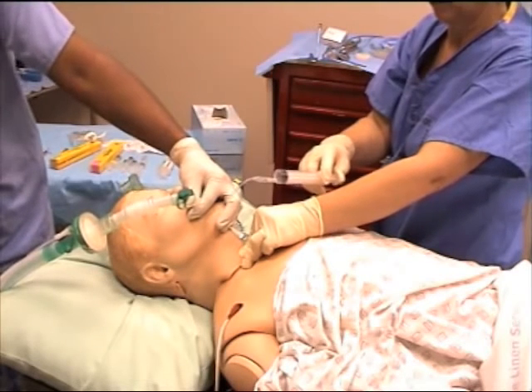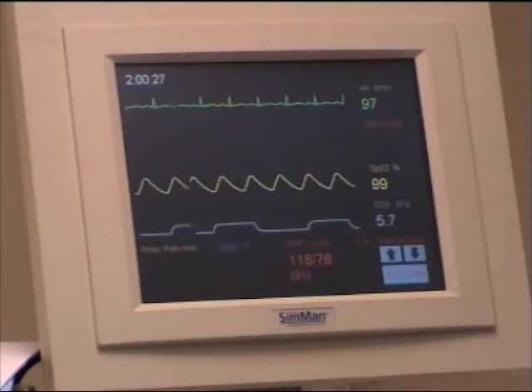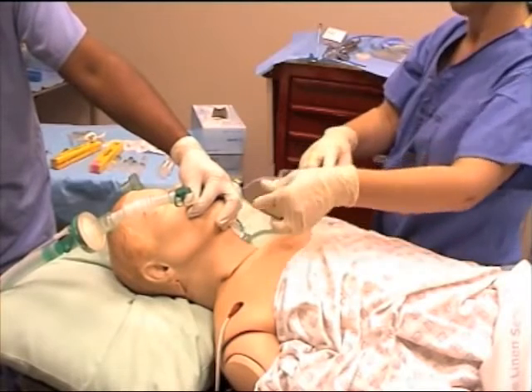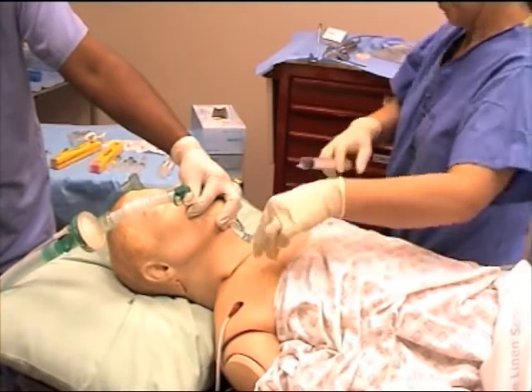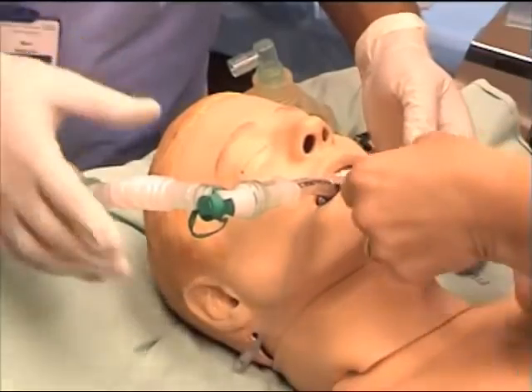Once intubated, confirm its placement by observing end-tidal carbon dioxide and also by listening to the chest at both axillae. Cricoid pressure can be released at this point only after a verbal request from the anesthetist. Secure the endotracheal tube according to local practice.